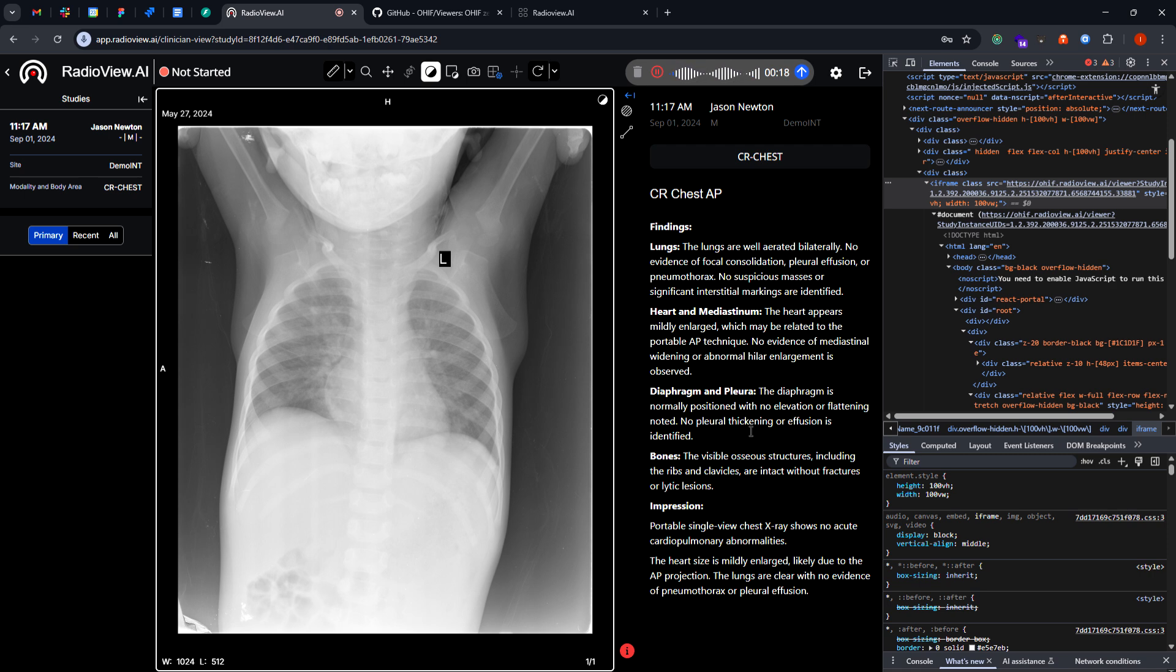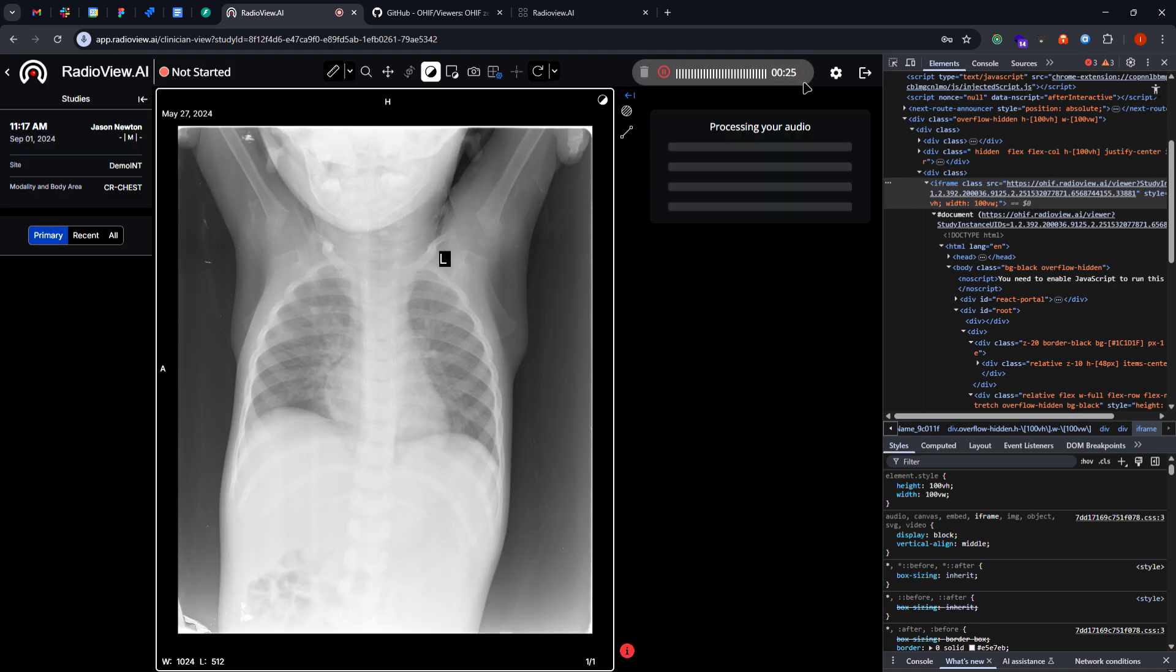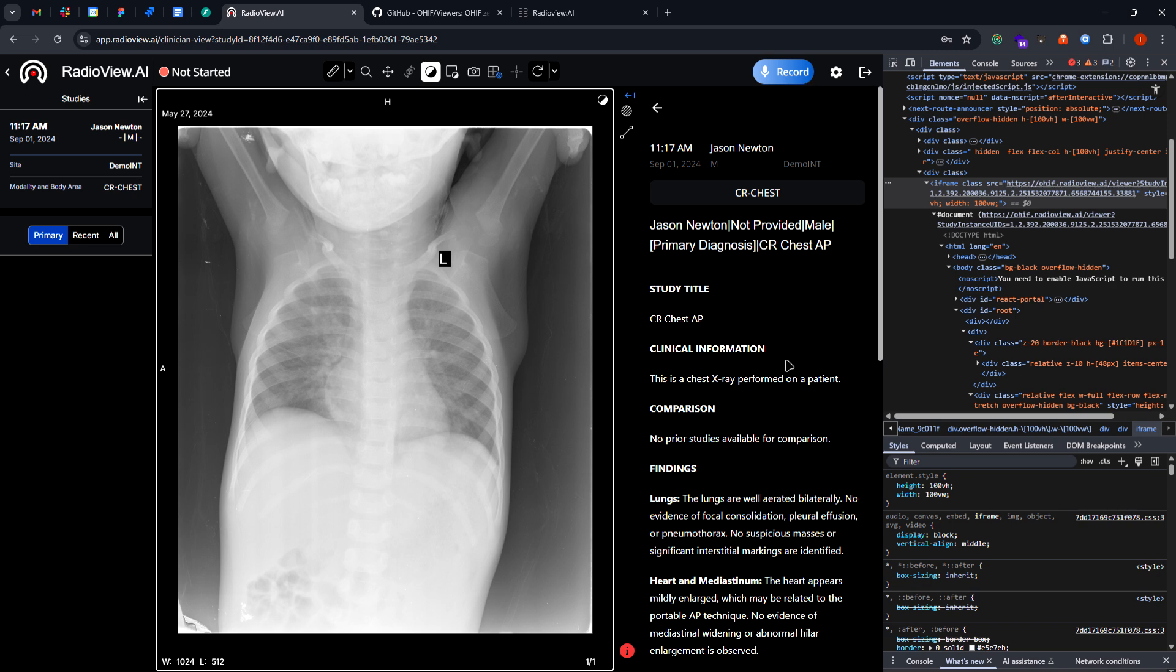So after that we will create an automated radiology report which will be generated through our ambient intelligence. So yeah, let's try that out.